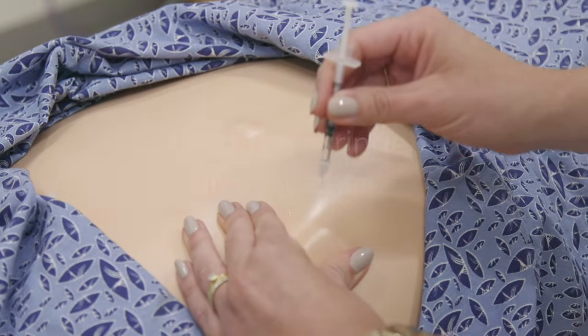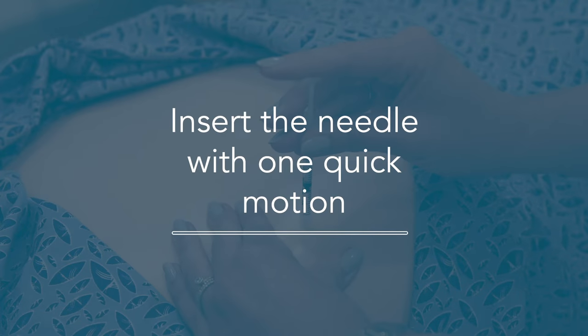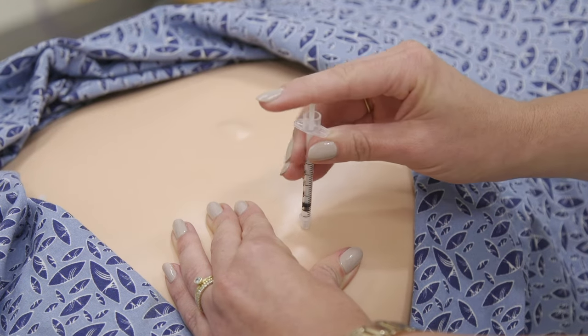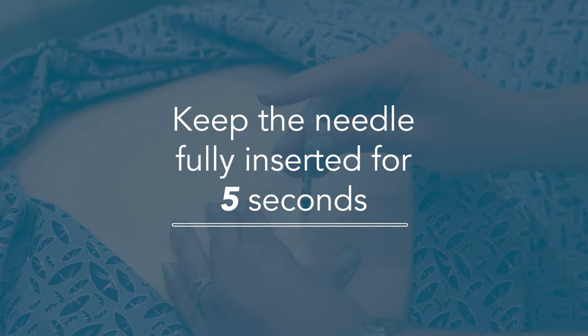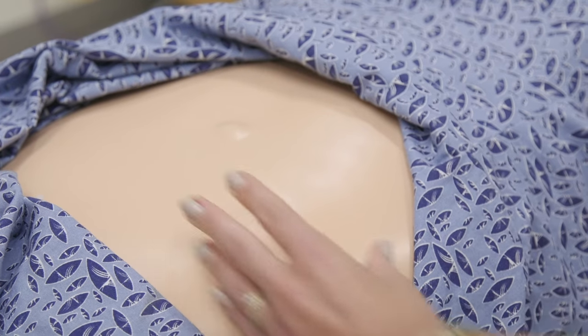With your other hand, hold the syringe like a pencil. At a 90 degree angle to the skin, insert the needle with one quick motion. Make sure the needle is all the way in. Push the plunger at a moderate and steady pace until it is fully injected. Keep the needle in your skin for five seconds. Remove the needle at the same 90 degree angle at which it was inserted.